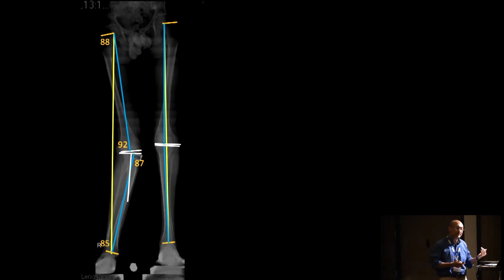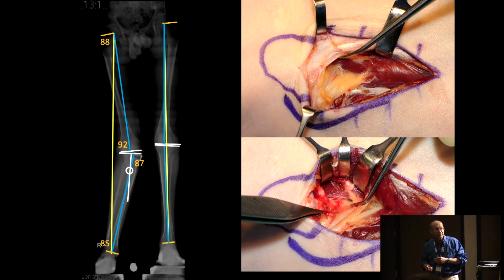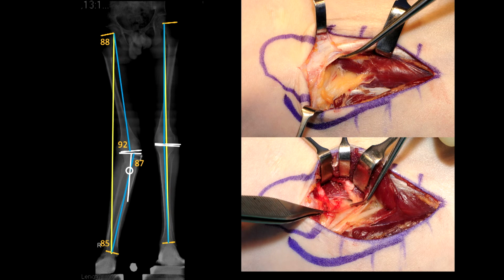Why not external fixation? This is an adolescent with autism. So this is a person who's fixator negative. So this would be a good indication to consider external fixator assisted correction. As I mentioned, it would be mandatory to consider a common peroneal nerve neurolysis.